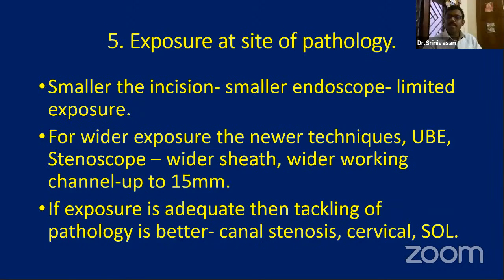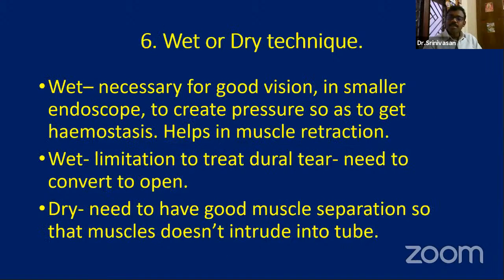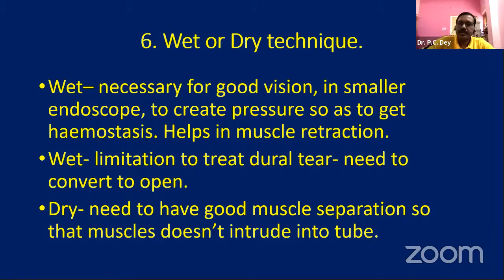Yes, sir. Many times, more than the disc, sometimes we see the facet joints causing the nerve compression, ligamentum flavum causing the compression, and additionally disc causing the compression. So all pathologies can be visualized well when we have enough exposure of the surrounding tissues, as Srinivasan sir was telling. So the entire pathology can be viewed only through this Destandau system, I feel. Correct. Absolutely. So, Srinivasan, I think it is already well taken. Now, next we can go ahead.